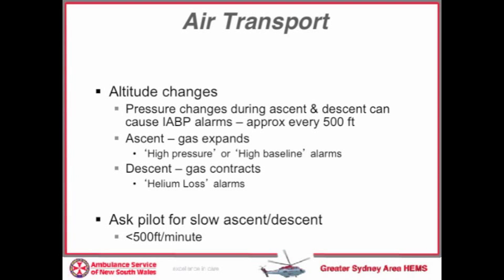Pressure changes with changes in altitude will cause the balloon pump to alarm approximately every 500 feet. This will be a high pressure alarm on ascent or a helium loss alarm on descent. Requesting slow ascent or descent from the pilot will mitigate but not entirely remove this problem.